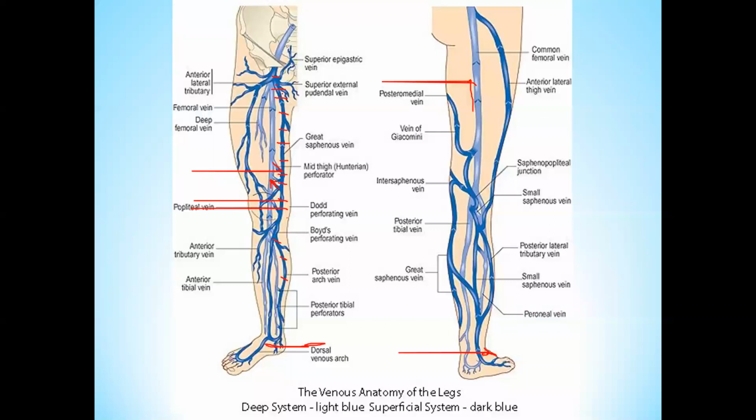While interrogating the entire superficial venous system in short axis view, while following it to the medial malleolus, you will find different perforators. Normally, the localization of a perforator is a bit difficult, but in cases of any abnormality, the perforator will be dilated and easy to localize. By applying color Doppler, in cases of an incompetent perforator, the blood flow direction will be reversed.